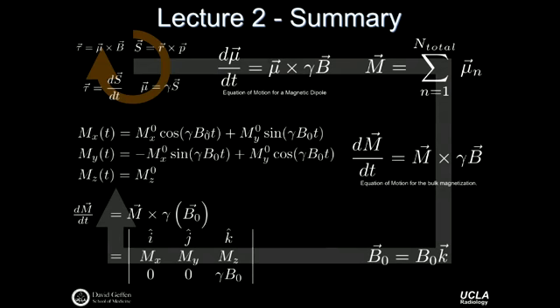And it turns out there are a lot of different B fields that we can use and observe how they act on the bulk magnetization. Today we're going to talk about the radio frequency B field and how it affects the bulk magnetization. We're actually going to get a solution that looks quite a bit like this, and so we'll be borrowing from the things that we saw in the previous lecture and building upon those for looking at the B1 field specifically.